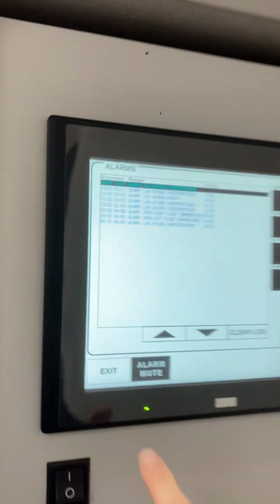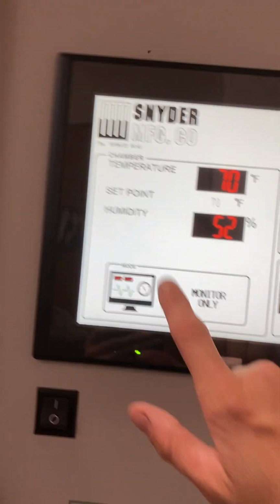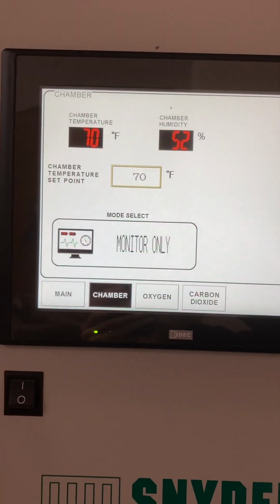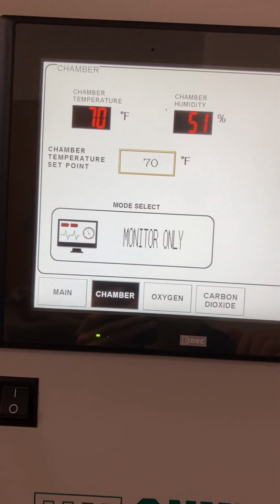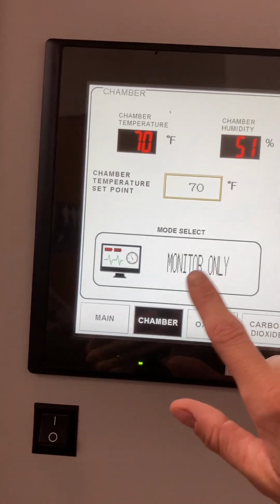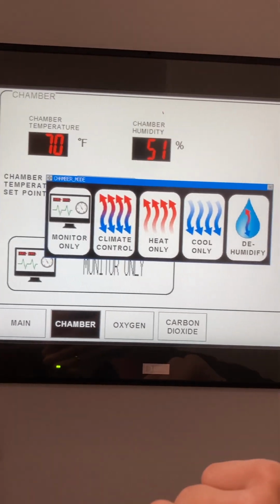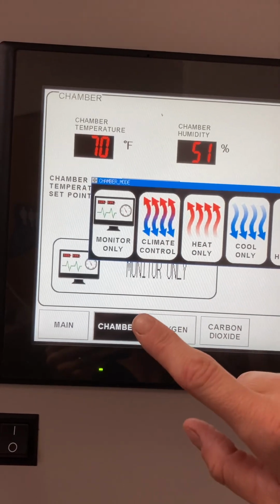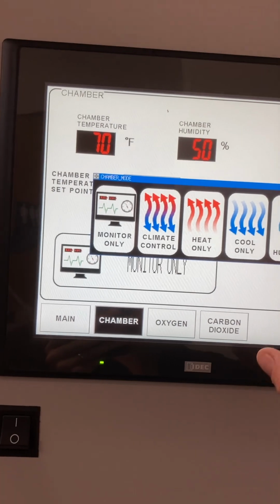Okay, so once your doors are shut, after you set your oxygen concentration, you need to go into the chamber temperature. Typically you set the temperature for the patient around 70, which is room temp. You can set it higher or lower depending on the needs of your patient. And then once you pick your right temperature, which we're gonna go with 70, go ahead and hit monitor only again and choose the climate control option, which will heat or cool the unit to the temperature that you need. You can use heat only if needed, or cool only, but typically we won't ever use those options. And dehumidify we'll talk about later.